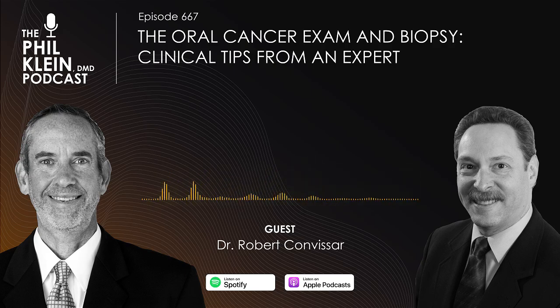So what do you recommend, Dr. Convissar, as far as the armamentarium needed in a typical general practice to do a thorough oral cancer exam? What kind of tools do we need? The best tools are a piece of gauze, your eyeballs, your thumb and index finger to palpate tissue, and I prefer to use a fluorescence visualization device.